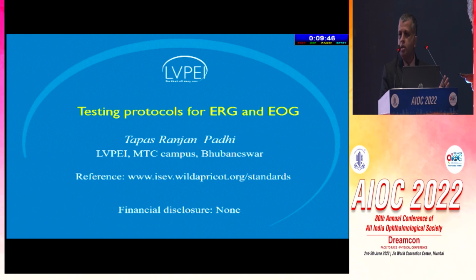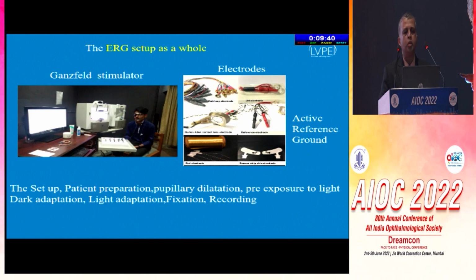The origins and the advanced protocols should be taken care of by other speakers. So this is the protocol that we are following and that needs to be followed as per the ISCEV standards. The updated standard is from 2022 for the ERG. The term electroretinogram here simply means a full-field or flash electroretinogram.